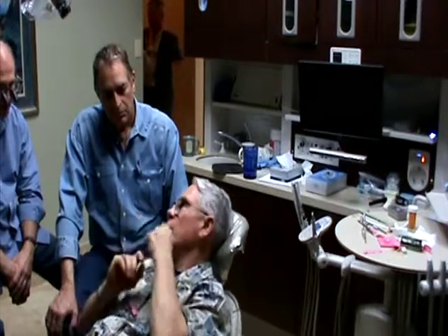Sometimes I hold it, because the patient may favor the side you're checking. You put it in and they want to go like this. So you've got to watch for that. They do it anyway, so I have my system: I put one here and one there, and I make sure they stay straight, not back or forward. For checking and balancing interference, they want to move to the side.